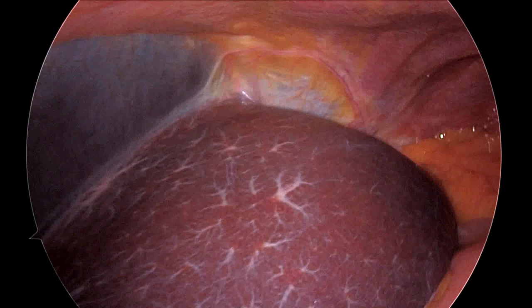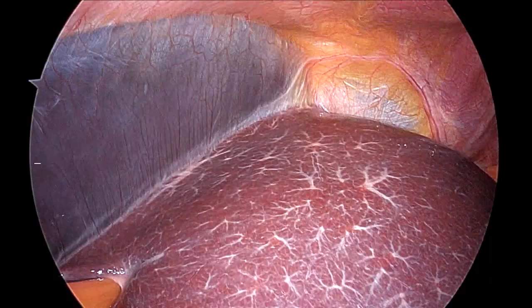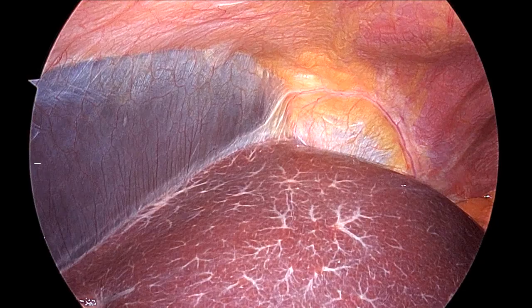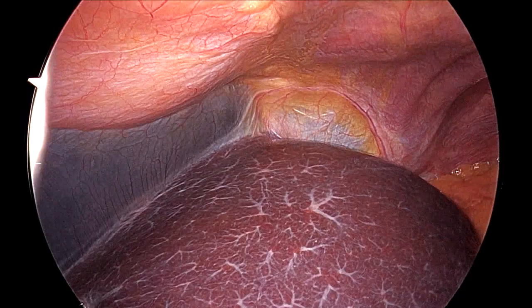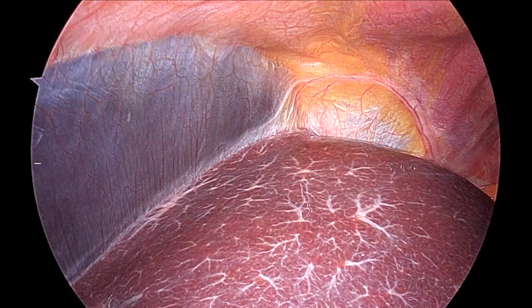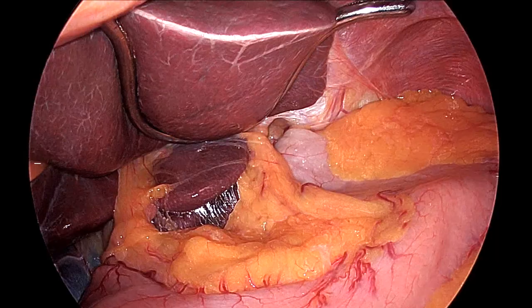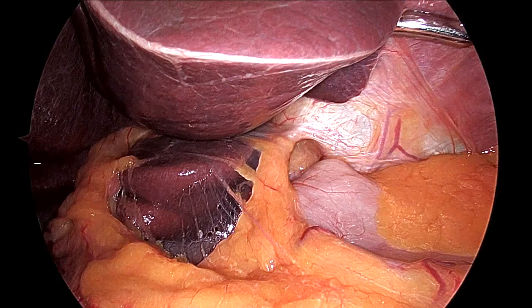Now we are going to discuss the laparoscopic Nissen fundoplication procedure, technical tips and tricks during the operation. After doing a diagnostic laparoscopy, we put a Nathanson's retractor just below the xiphisternum, and the left lobe of the liver is retracted with the help of the Nathanson's retractor.